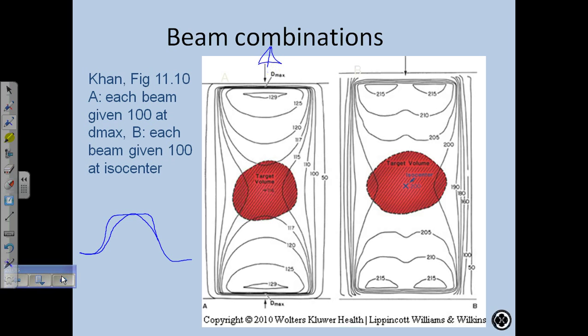The photons going through the center of the beam are much higher energy because they go through a lot of core metal and they're hardened. So as you get deeper, you start to lose intensity at the sides because those are the lower energy components and they get attenuated more. Okay. So as you lose that component, then at the edges of the beam the intensity starts to drop, and that's why this bows in. So just keep that in mind.